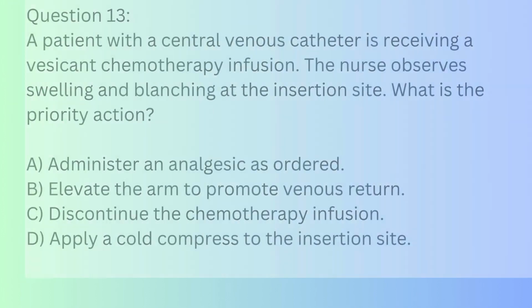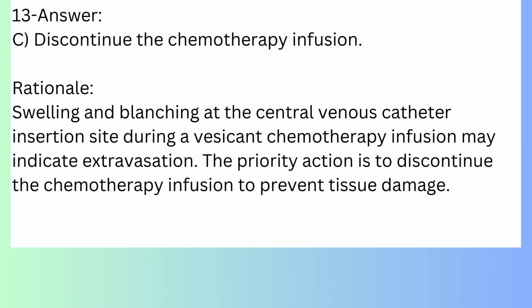Answer 13. C. Discontinue the chemotherapy infusion. Rationale. Swelling and blanching at the central venous catheter insertion site during a vesicant chemotherapy infusion may indicate extravasation. The priority action is to discontinue the chemotherapy infusion to prevent tissue damage.